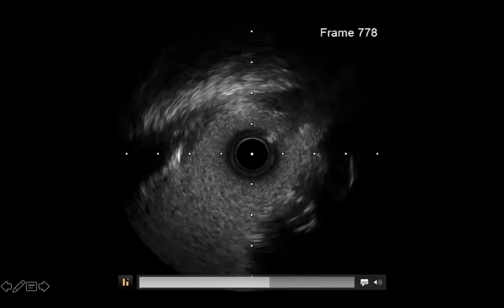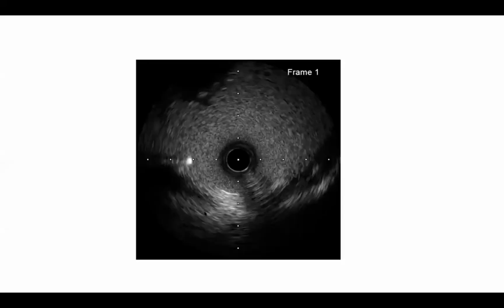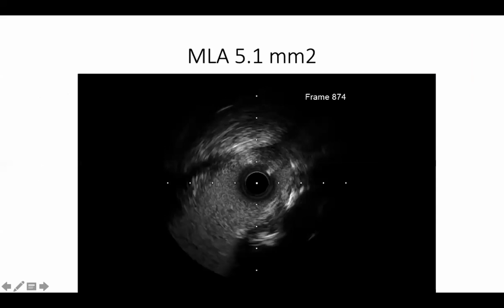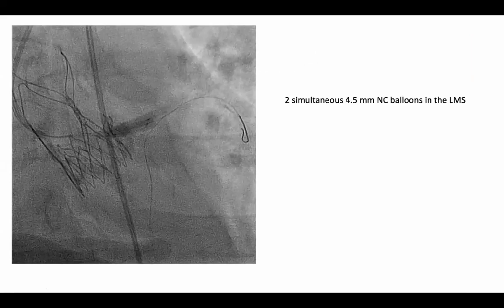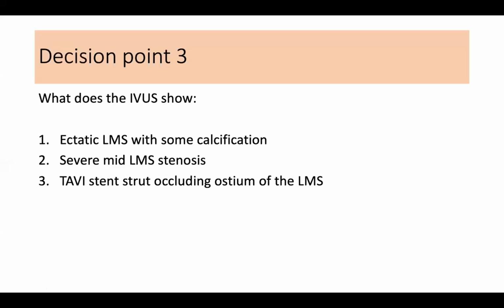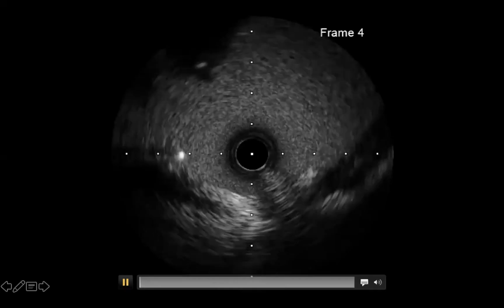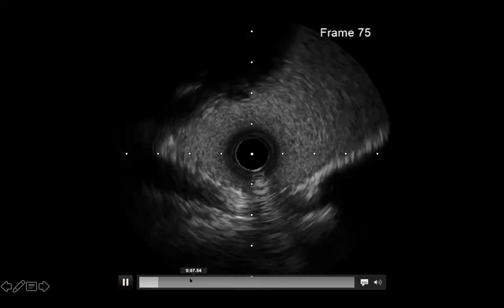One thing is that this valve has been implanted 3 years ago. And what we are seeing is in the body of left main, not necessarily in the ostium. So the chances of that causing any problem in the shaft of left main is pretty low. So I will probably exclude option 3. The other 2 options are interesting, although if I give a 4th option of others, probably Dr. Tariq will go for another one, saying that it is none of those. No, I won't say that.